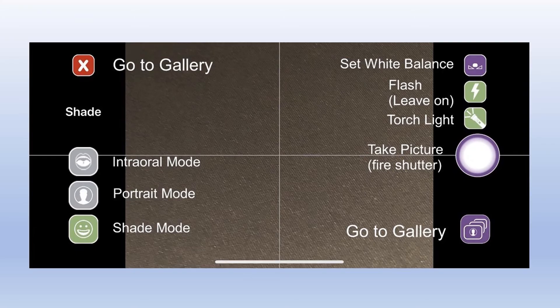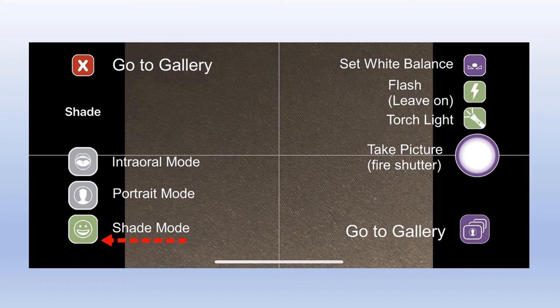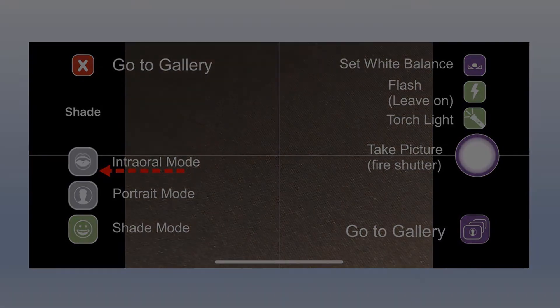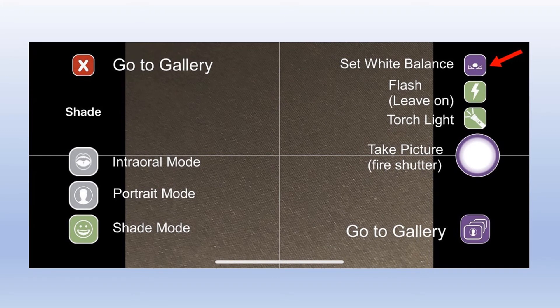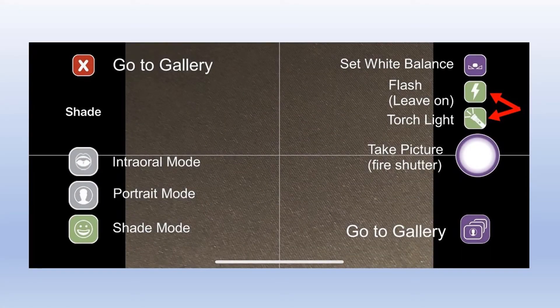Now that you're live, get familiar with the app's user interface. There are three shooting modes: the default, which is Shade, then Portrait and Intraoral. Moving to the upper right you have White Balance, also called color calibration — choose the icon and follow the prompts, and again you should be wherever you take photos. On the right, the flash and the torch or flashlight are on; it's best to leave them alone.